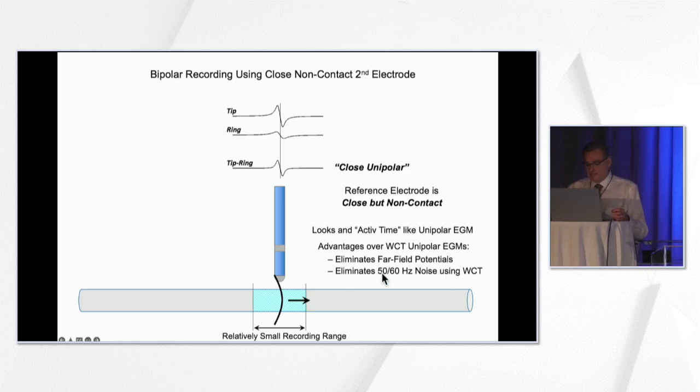Why do you get that noise? Or why do you eliminate it? Well, you eliminate it because now both electrodes have the same impedance for the amplifier. That's one good point. But more importantly, the wires travel together to the amplifier, so you get common mode rejection. And that's the reason you get rid of the noise, and you don't have to use bad amplifiers. That drives me crazy. Everybody uses the notch filters, and I think they're the biggest enemy that we have. I don't ever use them.